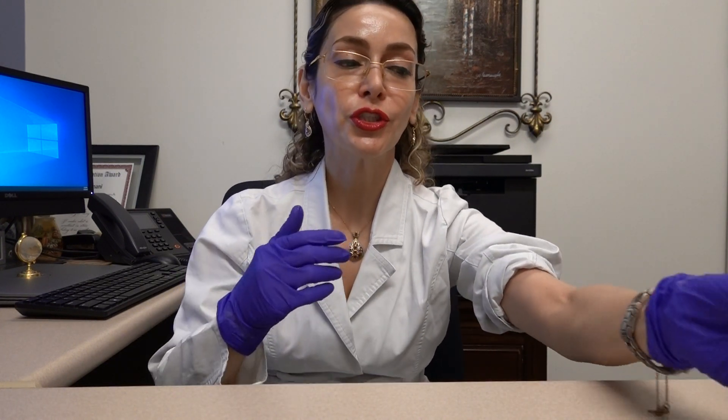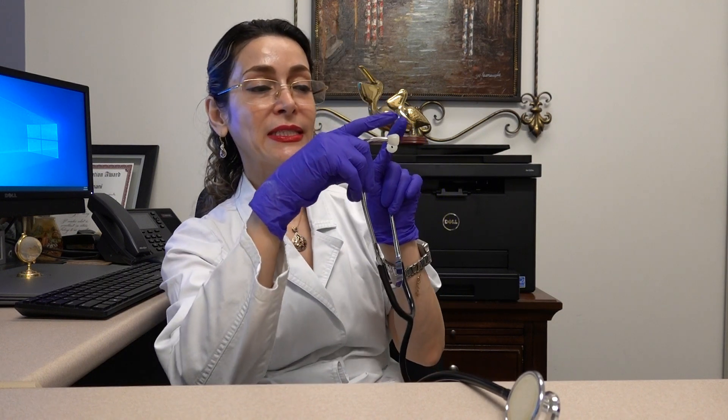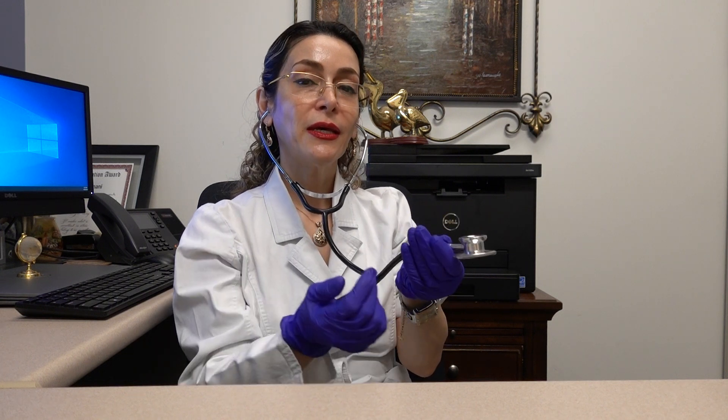Next in this video, I want to quickly show you how to use a stethoscope to listen to the heart sounds. First, after cleaning the earpieces, make sure that they sit forward, following your ear canal — that's very important. After you place them, tap on the chest piece. If you don't hear anything, it means it's off and you have to turn it. When I tap on it now, I can hear the sound.